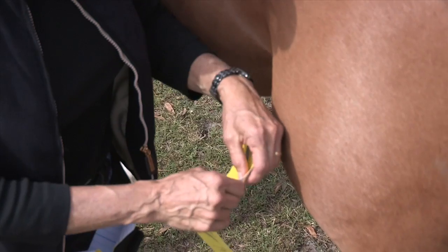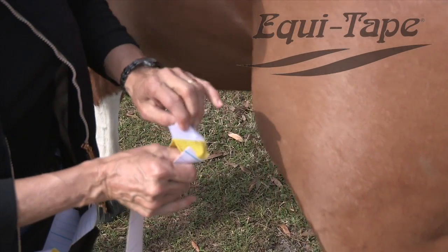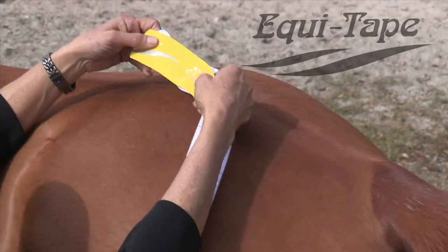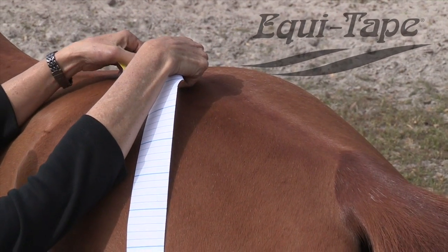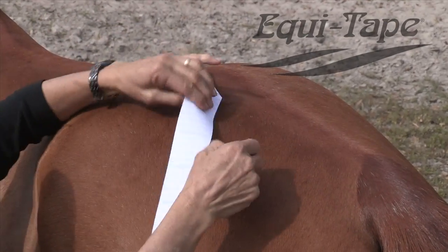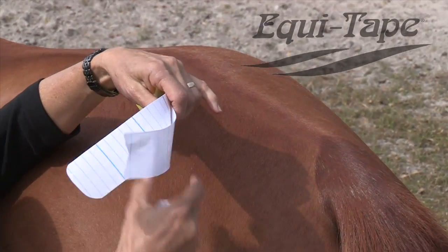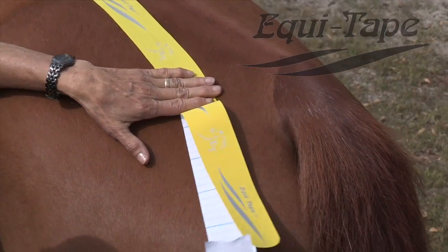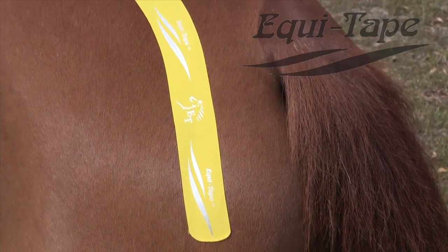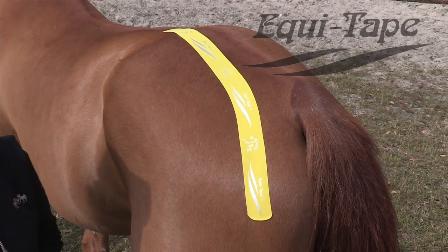I'm going to tape the gluteal muscles. You might consider taping your horse's gluteal muscles if your horse is hard at work, or he's sore over the area of the muscles, or for rehab. It's a great taping to facilitate training if the horse is working hard. To use this taping during training, it helps bring more oxygen to the muscle and helps the muscle work better with less of an oxygen debt.